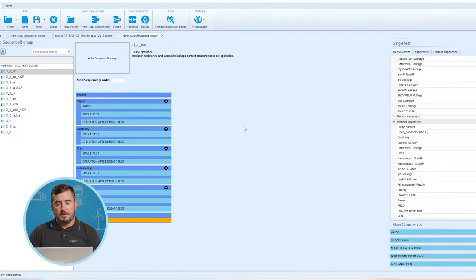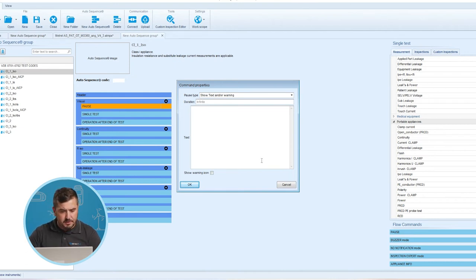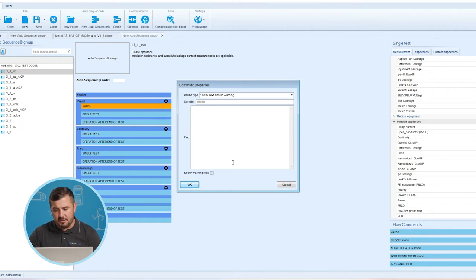Flow commands Operation After End of Test and Flow Command Result Screen are entered by default; the others are user selectable from the flow commands menu. The Results Screen flow commands control what happens after the auto sequence has ended — the option auto save, or in some cases auto print, can be enabled in this step of the sequence. Double-clicking on an inserted flow command opens a menu window where text or a picture can be entered, and external signaling and external commands can be activated with parameters set.